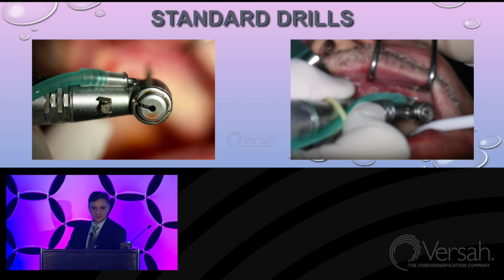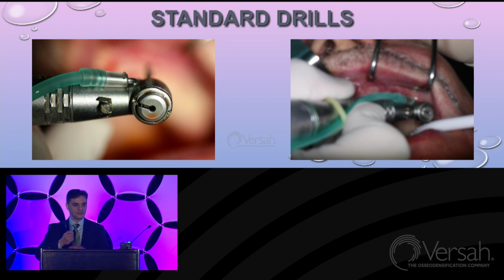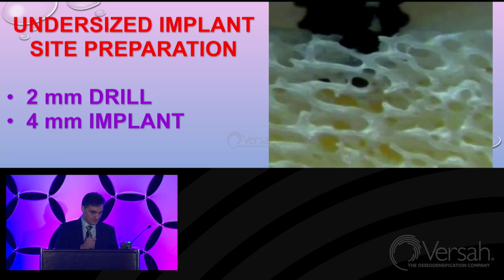We can use standard drilling preparation to increase the stability by reducing the diameters of the drill. This is one possibility that many of us are using today. We can use, I would say, aggressive implant threads, self-tapping, cutting implant threads, and by undersizing the implant hole, we will improve the insertion torque and somehow the primary stability. And this is what many of us are doing. With experience, you get trained to do this. I will show you a study that we did using 2 millimeter drills and placing 4 millimeter implants in animals.